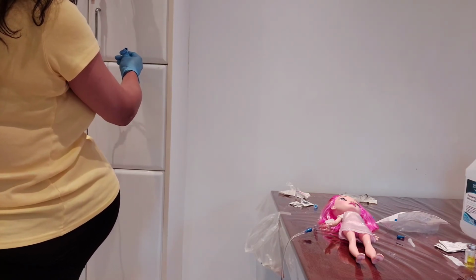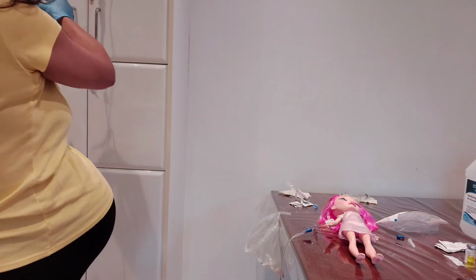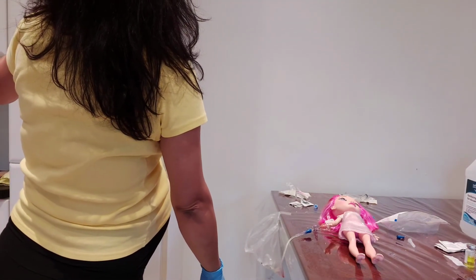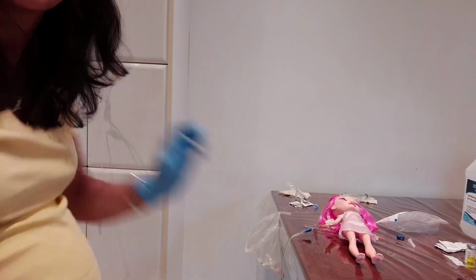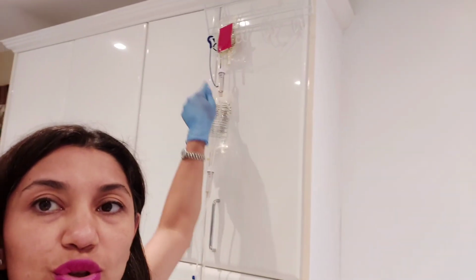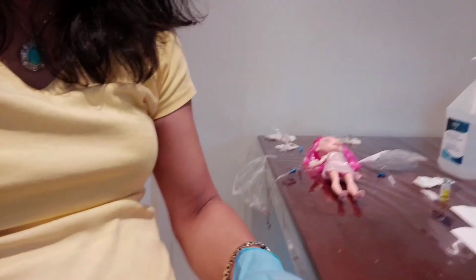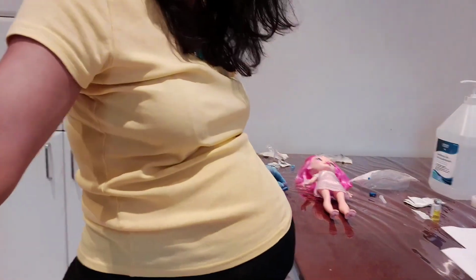I will open this one as well. I will calculate in 1 minute. It should be 17 drops, and it comes down into the patient's hand through the secondary line. So now everything is okay.